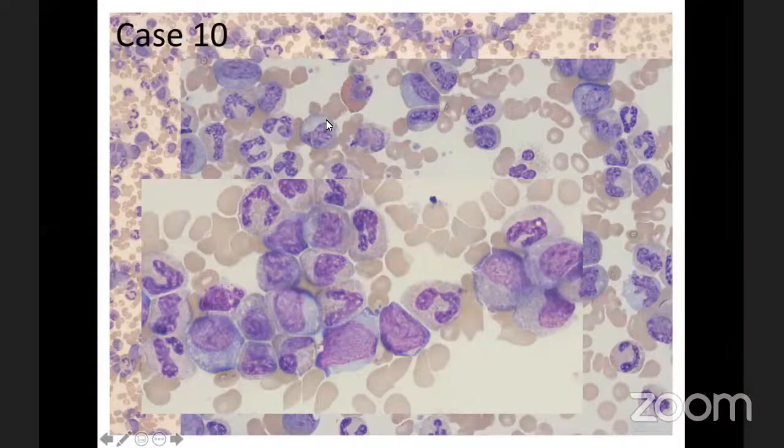So if you think that this is a chronic disease, a case of MPN, myeloproliferative neoplasm, yes, I agree with you. Most of you mentioned that this could be a CML. What test is going to confirm your finding? For chronic myelogenous leukemia, Fatma said CML chronic phase. I agree with you. The picture is going with CML chronic phase. So what tests will confirm this assumption?